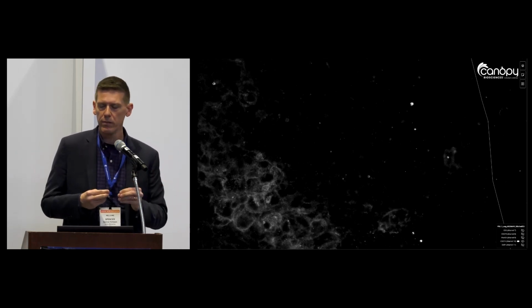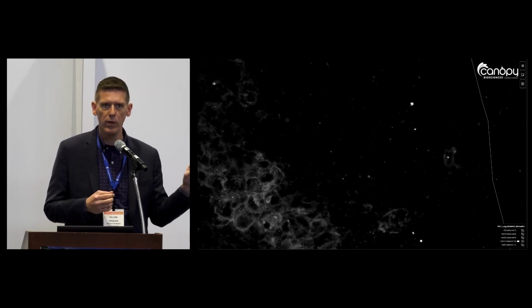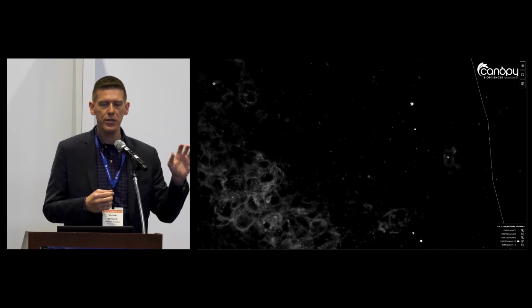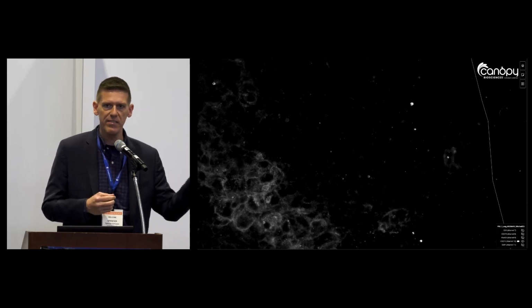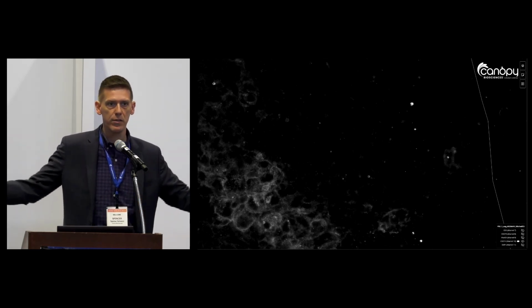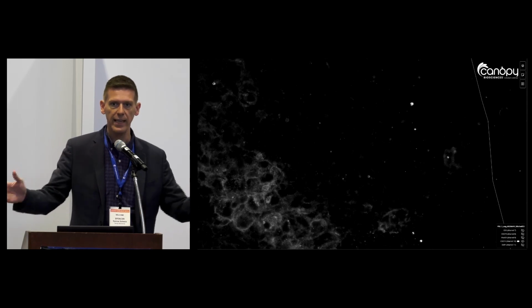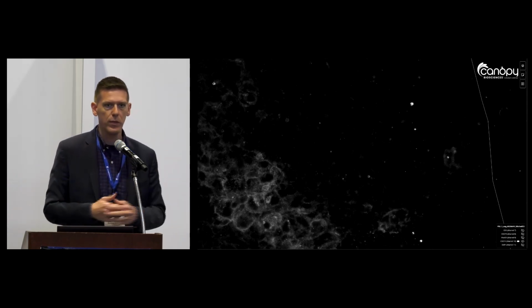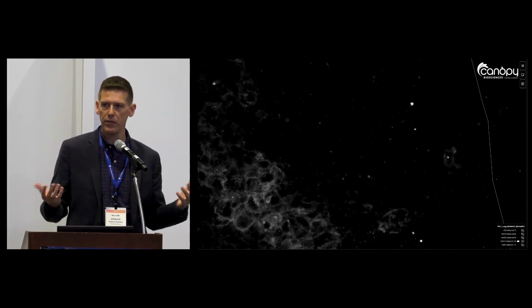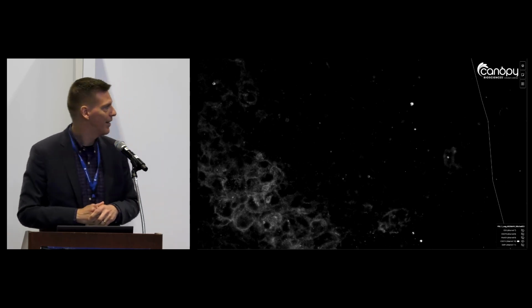So the question, more precisely, is not necessarily whether in a binary fashion these tumor cells do or do not express PDL1. Really, the question is: is that expression so high that you would consider that a disease state? So that's really what HDR can do for you. By capturing that entire expression range, you're able to rationally place the expression of particular cells within that gamut. We can do that over samples. We can do that over different tumor types, all because of this idea of HDR capture. So it can be a very intriguing addition to your arsenal.